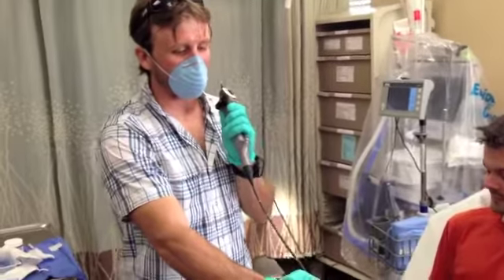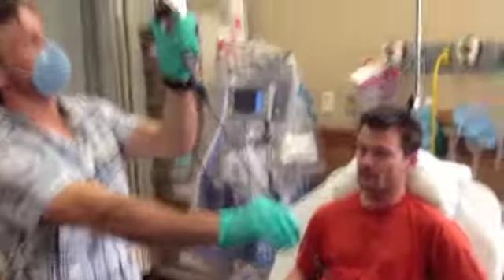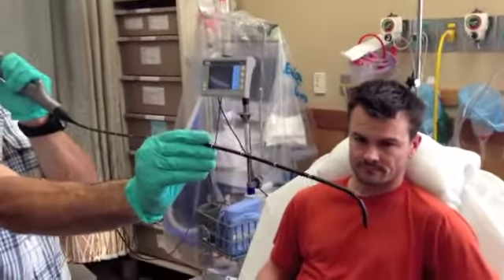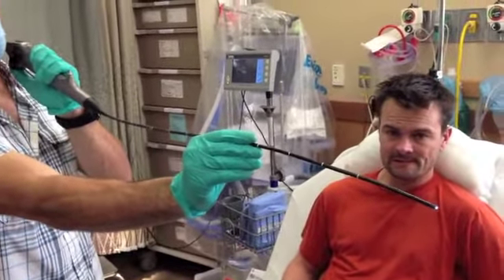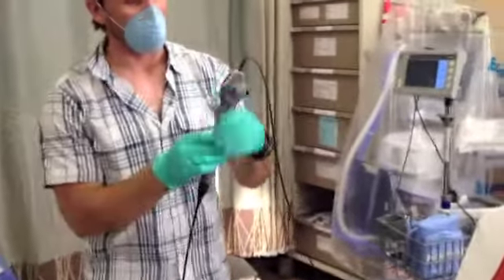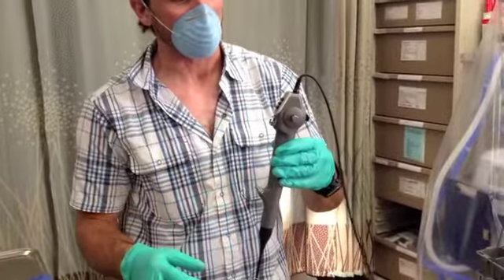So I'm by no means an expert, but driving the scope is fairly straightforward. You have one control here that you operate with your thumb that bends the scope anterior, posterior, or up and down, obviously depending on the relation to the patient. There's also a couple of ports here that Travis is going to be able to talk about: a suction port, and a port for injecting medications.